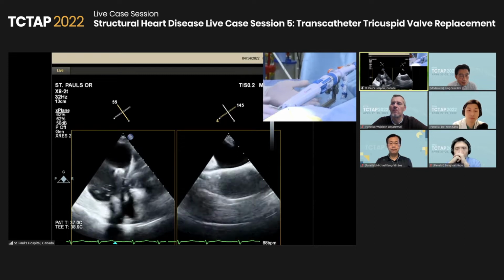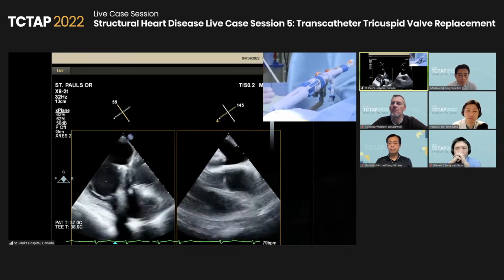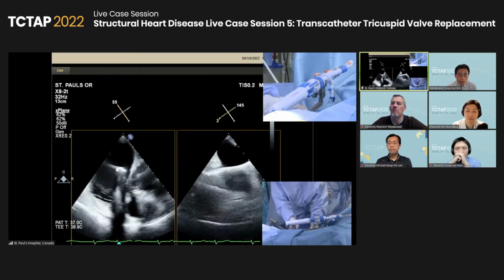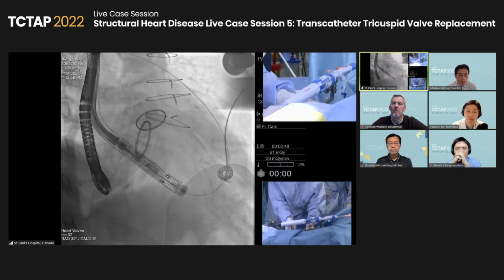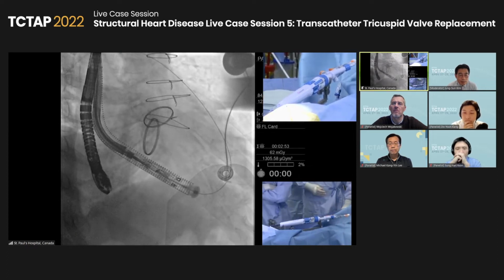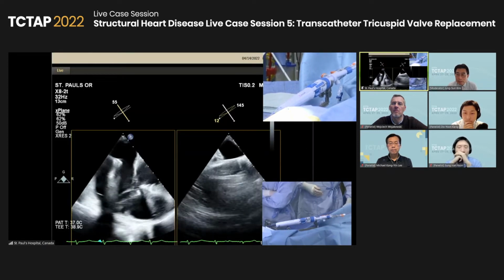This holder allows me to advance the catheter. When we advance it towards the foot, that means I move the whole thing posteriorly, which I'm going to do right now. Forward, please. That moves it more posterior and also further into the right ventricle. So how do I look at that right there? You've definitely moved more posterior there, Anson, but you're still fairly septal in your position.